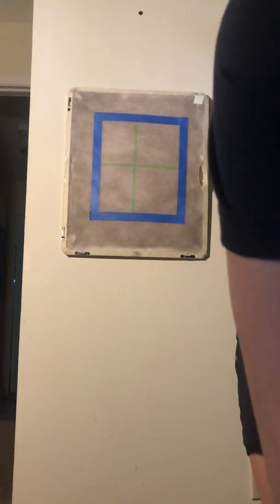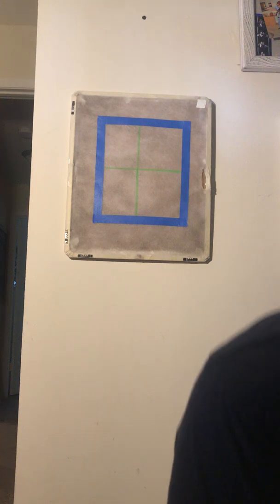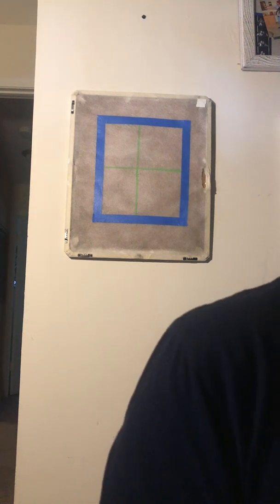The next we're going to be doing is the Grashy view, and this is going to have a 30-degree body rotation. So in this case, it's going to be an oblique view. My shoulder is leaning up against the bucky, and I'm rotated at 30 degrees with the central ray going through right here. It's 30 degrees oblique to accomplish the lateral glenohumeral joint in the viewing and the body of the scapula. The patient's rotated obliquely following the curvature of the posterior ribs.